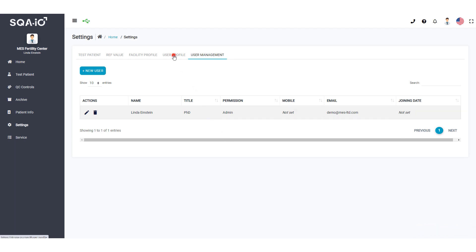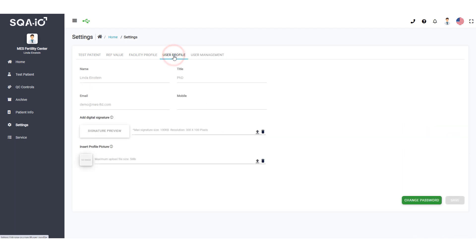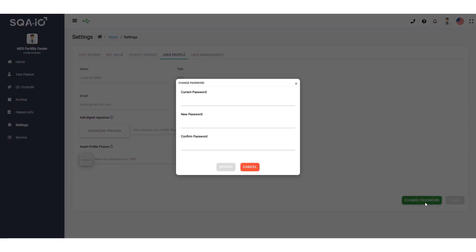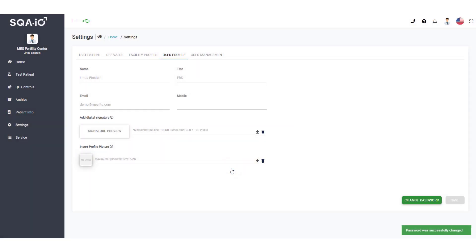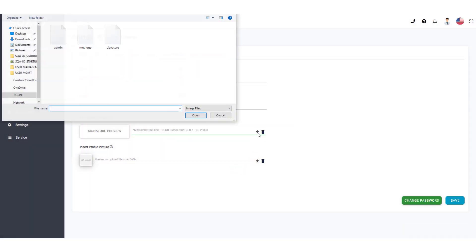Click User Profile to change your password. Upload your report signature here.